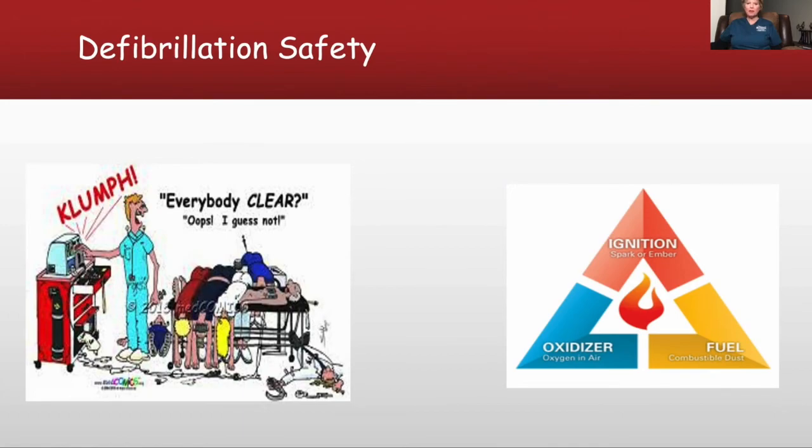A little bit about defibrillation safety: when you are in charge of the monitor defibrillator, you should always have your eyes on the patient when you are pushing the shock button. Stuff can happen in nanoseconds when you've looked and you're clearing and then you turn back and look at your monitor.